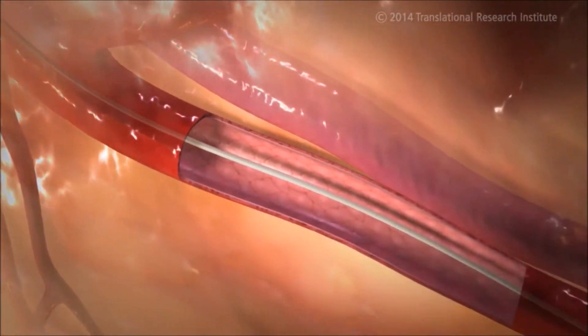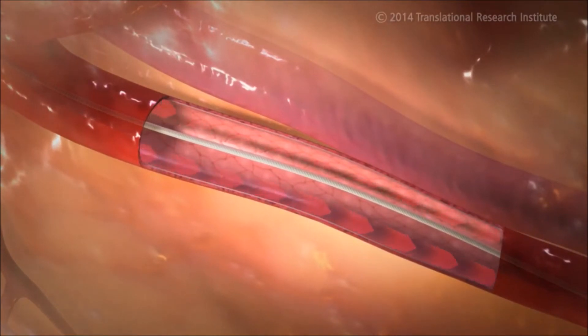The ND infusion catheter is introduced over the guide wire and is positioned within the intended segment under fluoroscopy.